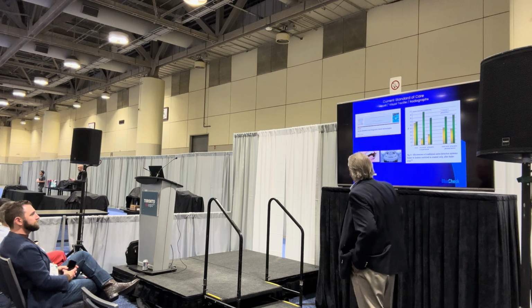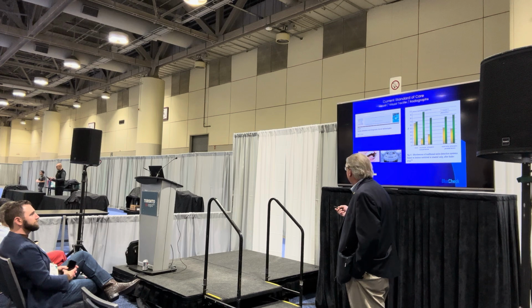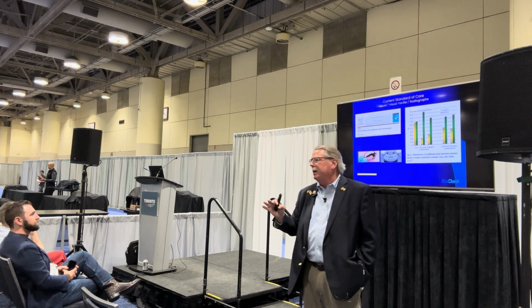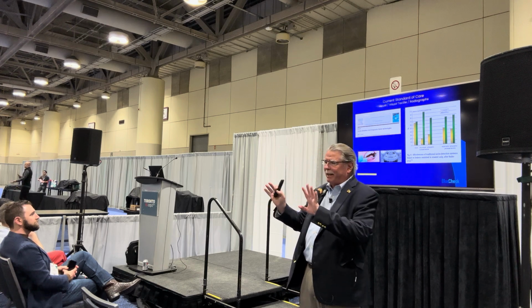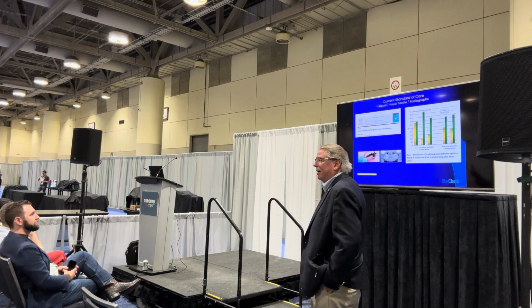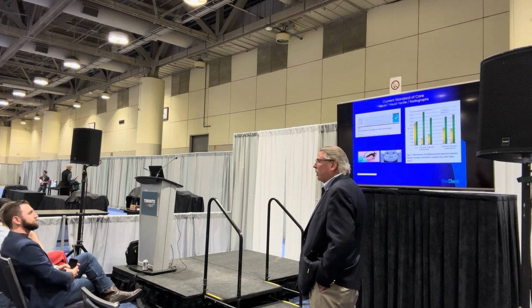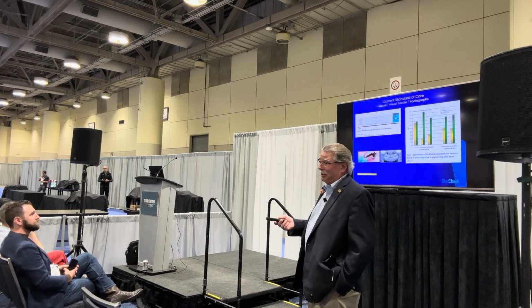So what happened at the end of our trial? This is a paper that was published in the Journal of Dentistry, and this is 2006, guys, and we were just finishing up our stuff that we did before we started doing restorative and tracking it with QLF. And I'm not going to talk about that because we're just doing diagnostic stuff today. And this is the standard of care still. After almost 20 years of work, but at least 10, we're at the same place we started. We're using explorers and mirrors. We're still doing it today.